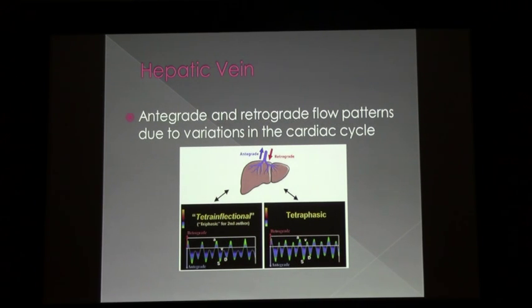I have a mnemonic if it's backwards. If anyone wants to know, you can ask me. Hepatofugal is messed up flow.